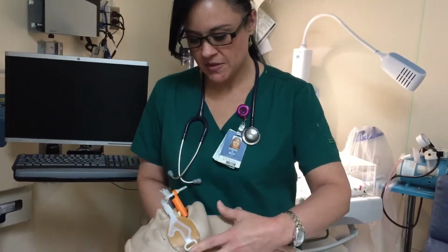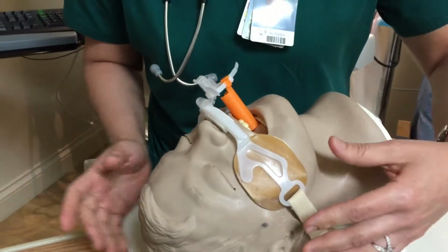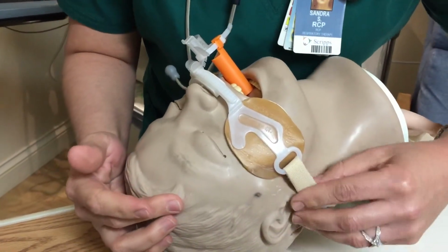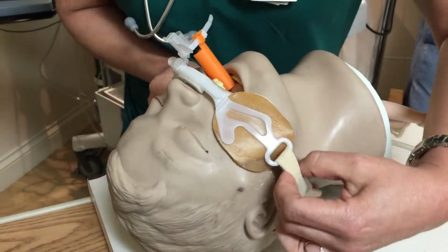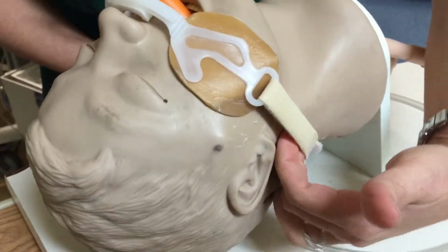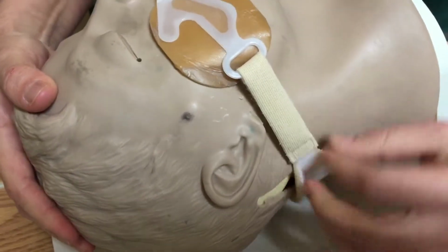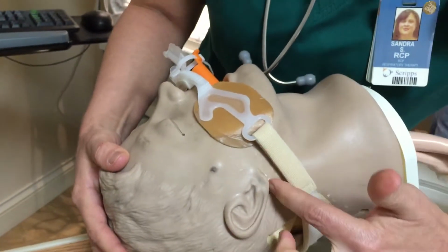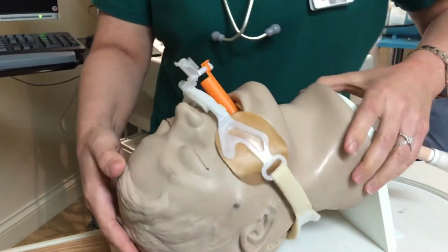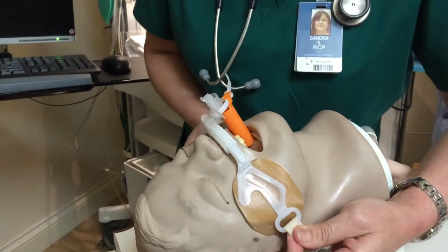Now we're going to present the ET tube, the movement of the ET tube. So this is the Hollister, and so we're going to first of all always inspect the skin. When we place the Hollister, make sure always that you're able to place 2 fingers on either side. You're going to be checking the skin, that there's no redness, especially under the ears here. There could be erosion. Always communicate with your nurse if you find something, and document.